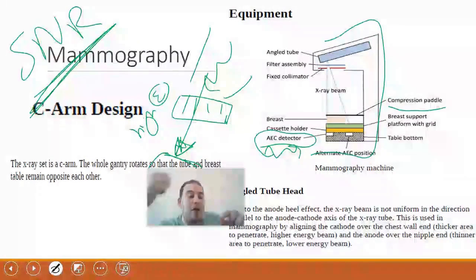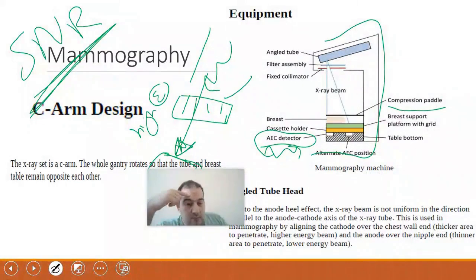I start by making adjustments to the signal to noise ratio and the energy I want, along with the factors I need. It stops the exposure, meaning the first time it detects an incident, it reads and starts to say, now I have reached the number of photons or the energy I want, so I will stop. When it stops the scan, it stops the exposure. This happens in no time. I'm not saying this takes time. It occurs in less than a second in some cases.